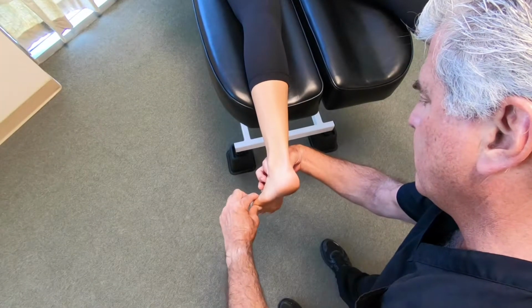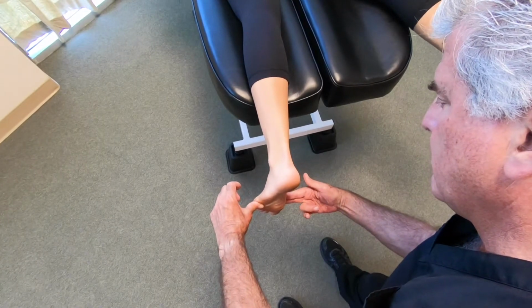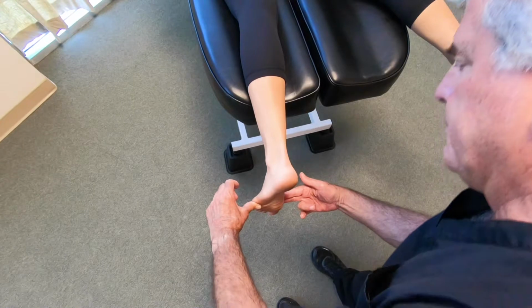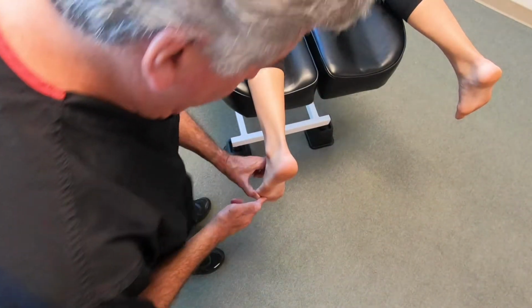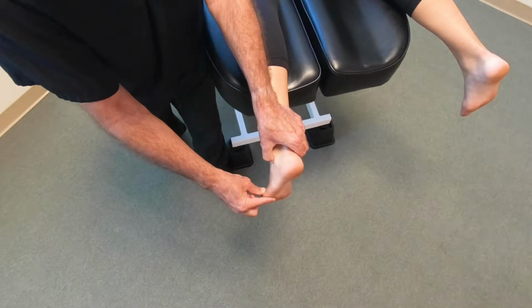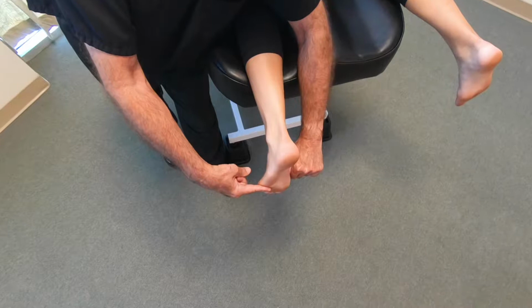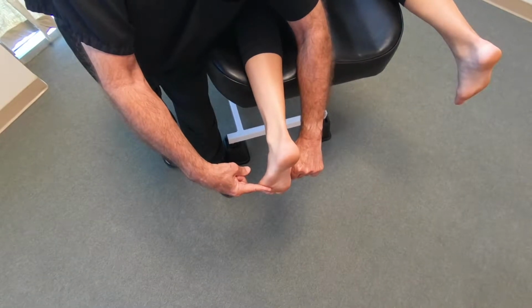Prone positioning is actually preferred when taking a digital cast for the Richie Brace. It allows a better view of the critical anatomy of the posterior ankle, foot, and lower leg. Positioning of the foot is still critical while the patient lies prone.